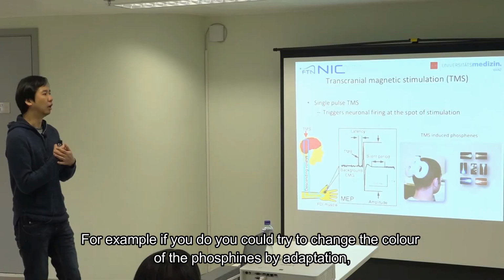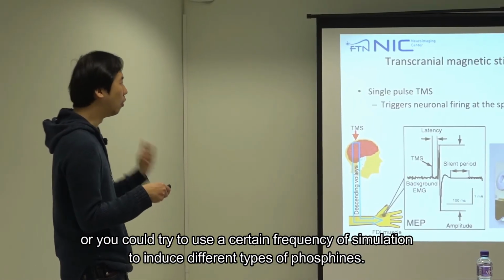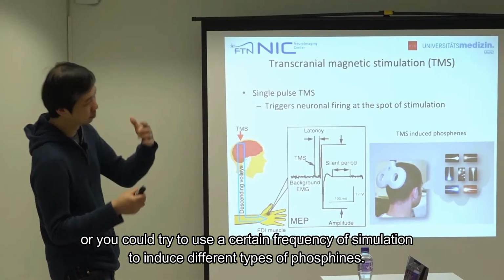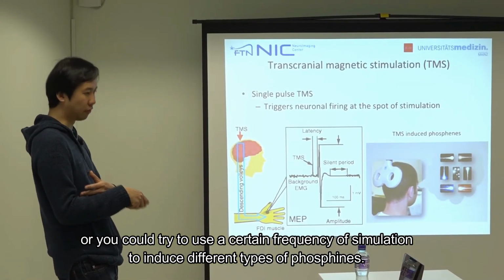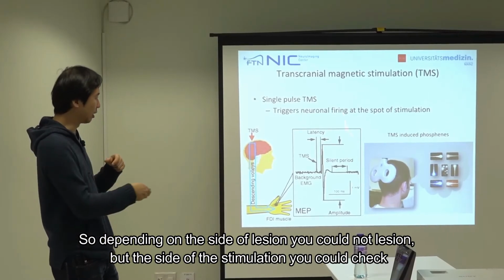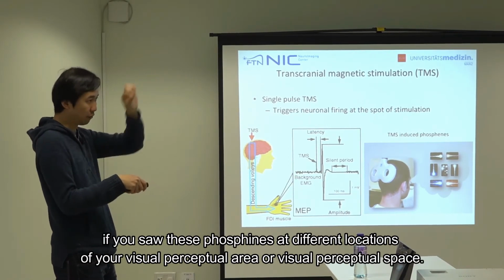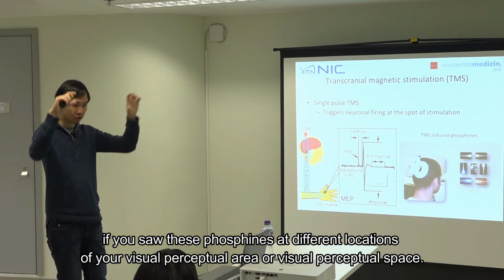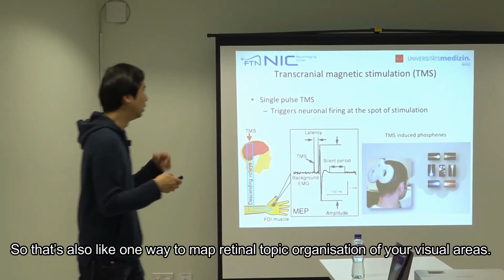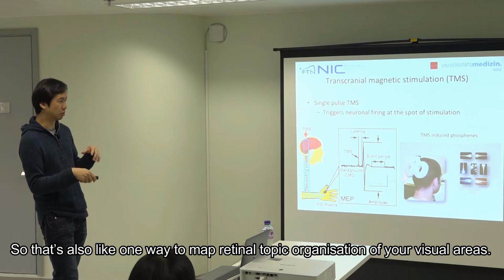For example, you could try to change the color of the phosphenes by adaptation, or you could try to use a certain frequency of stimulation to induce different types of phosphenes. It also appears in different parts of what we call the visual field. So depending on the site of stimulation, you could check if you saw these phosphenes at different locations of your visual perceptual space. So that's also one way to map the retinotopic organization of your visual areas.